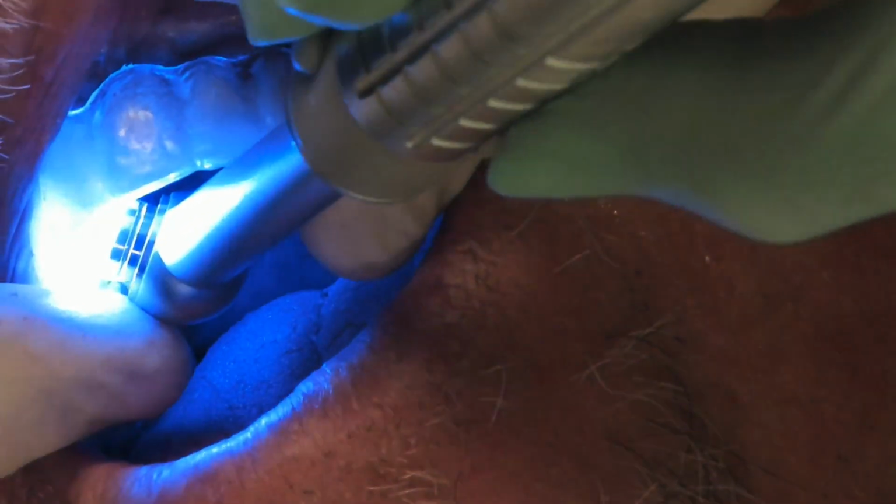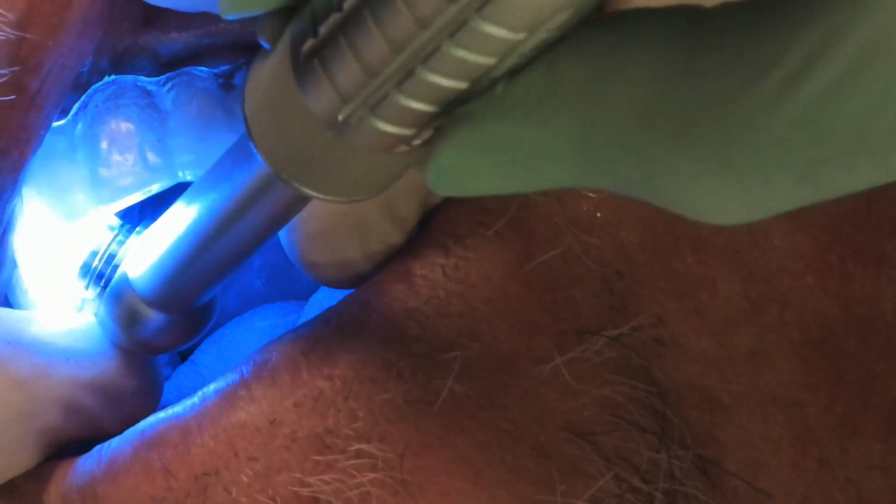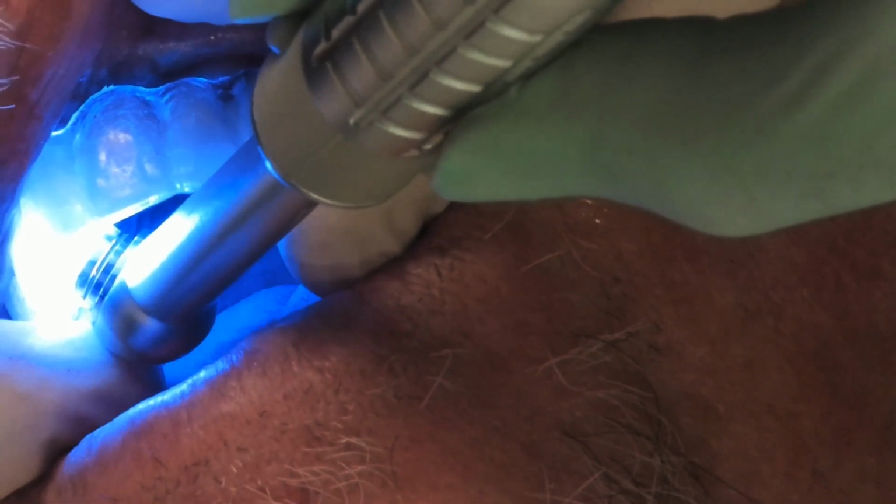All right. So now we've just put some regular composite, not flowable, into the sites. I'm just trying to index the head.